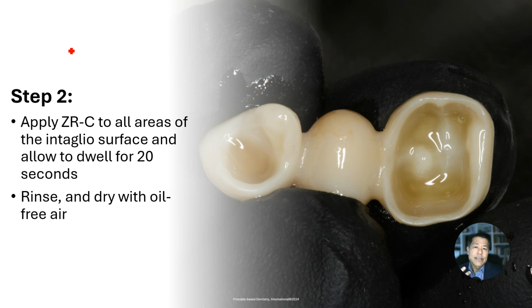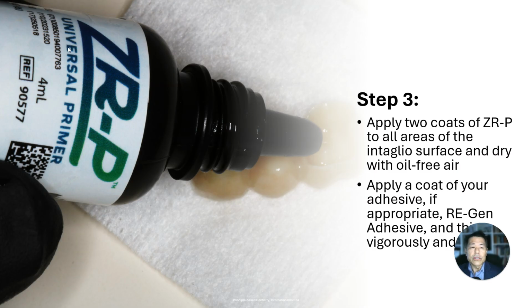And the nice thing about this is I've used some solutions that have colors in them that, when you rinse it out, the color stays behind. I have not had this problem with the ZRC.